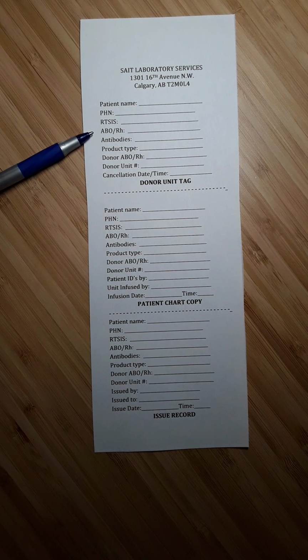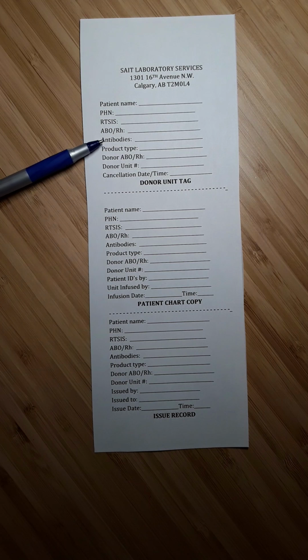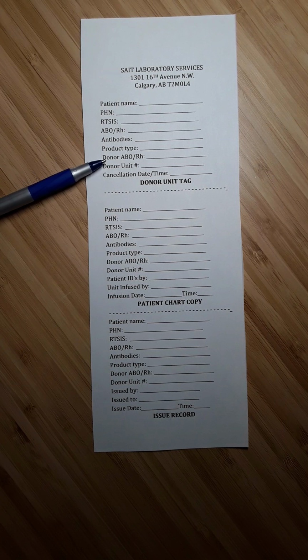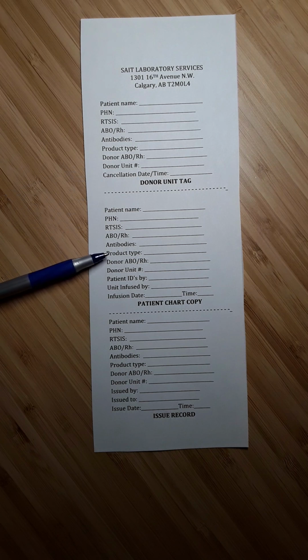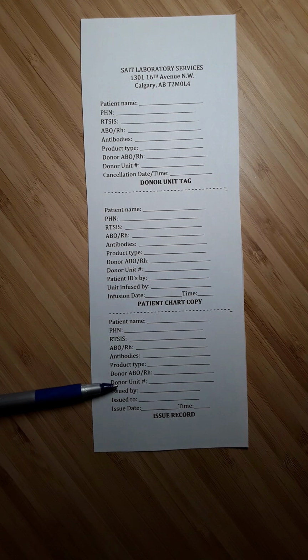On all 3 portions of the tag, you write the product type, which is red cells, or perhaps plasma, or perhaps platelets. You write the donor ABO and RH type on all 3 portions of the tag. You write the donor unit number, which is found on the donor unit. That gets written on all 3 parts of the tag.